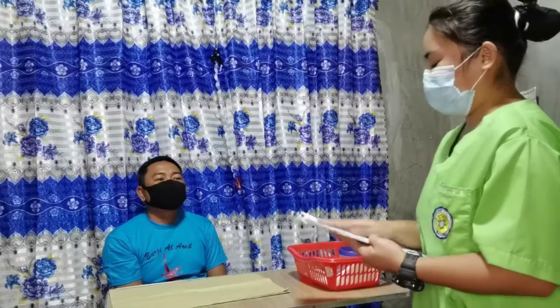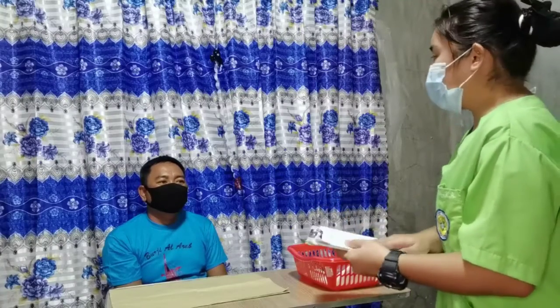Evaluate the patient's response to the medication within an appropriate time frame for the medication. Document the procedure in the patient's chart.